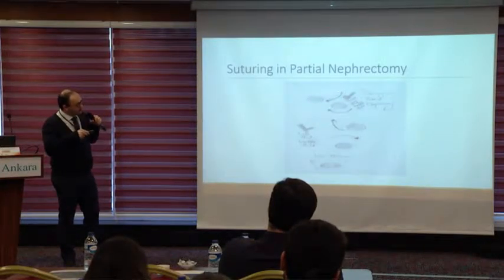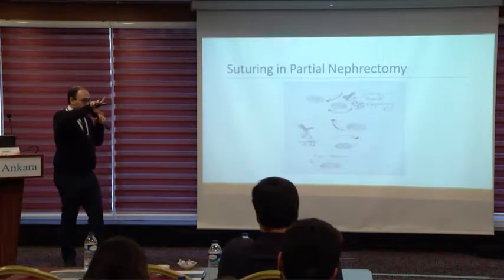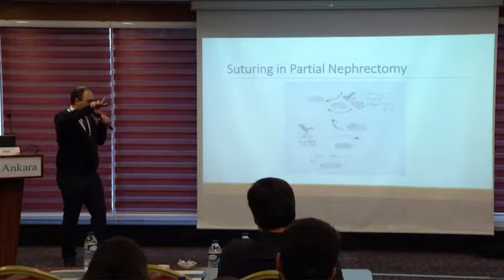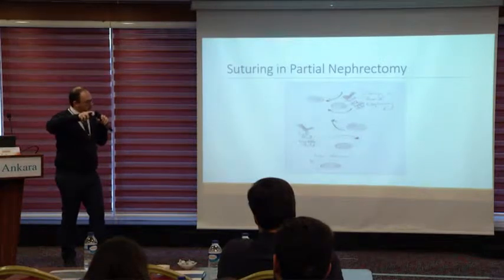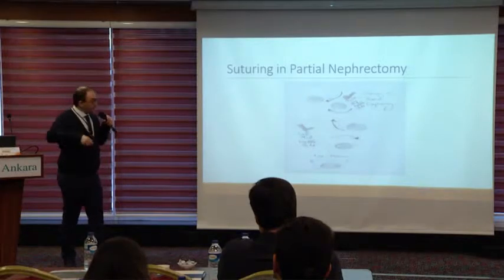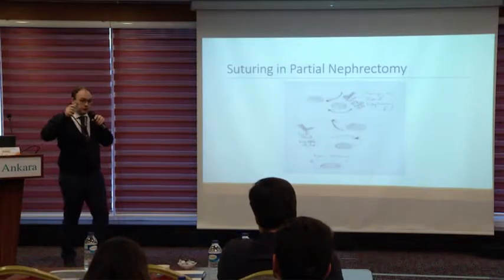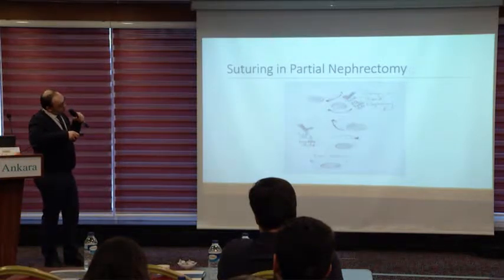If you make this movement in 3 dimensions, for example, if you are not making your movement like this, it can be, but this is problematic. Probably you will miss a hemostatic point of the vessels. But if you are making your movement like this in 2 dimensions, then you will get what you see on the screen. You see my net movement.